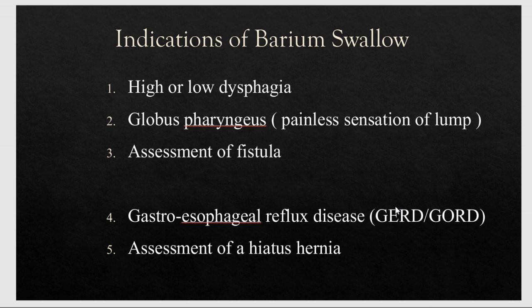To be more specific, the indications of barium swallow: if we are suspecting high or low dysphagia, if something is there in the upper esophagus or the pharynx, or the mid part of the esophagus, or the gastroesophageal junction, if some swelling is there, or if something is hindering the function of the esophagus, this barium swallow can be one of the options.